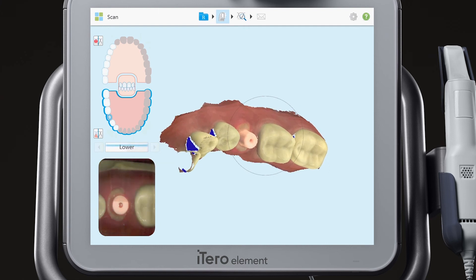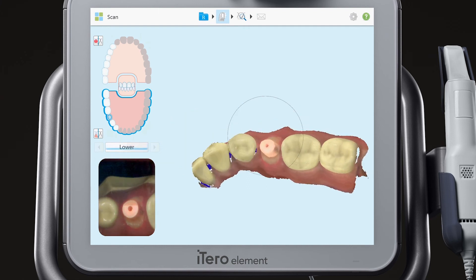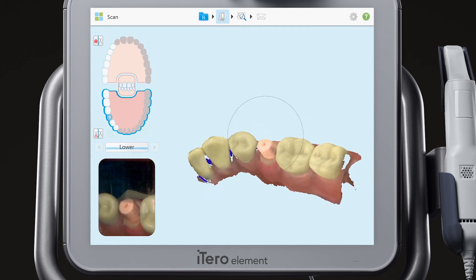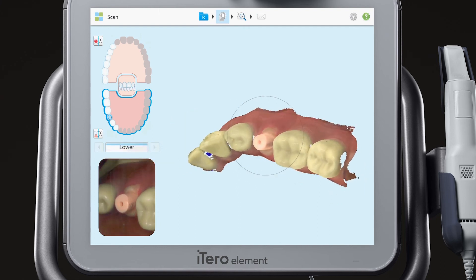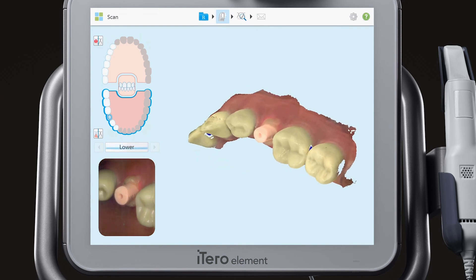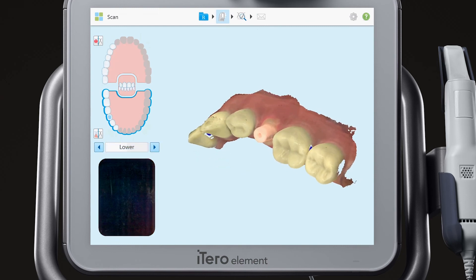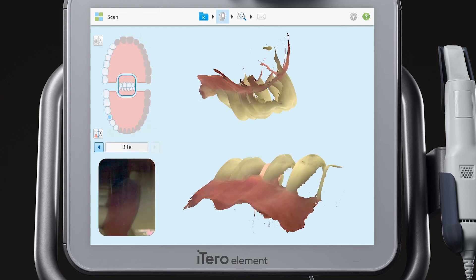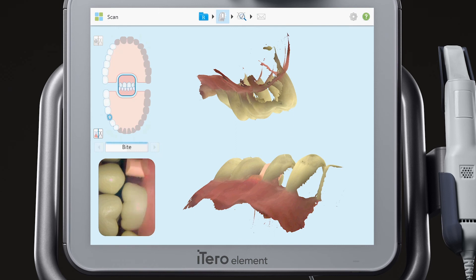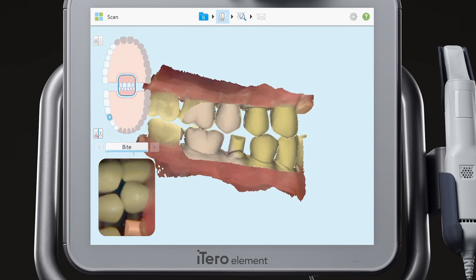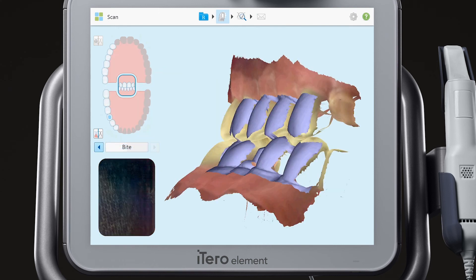Remove the scan body to capture contact anatomy if necessary. Use the arrows to move to the bite segment. Scan the bite ensuring the patient is in proper occlusion. Remove the scan body if necessary.